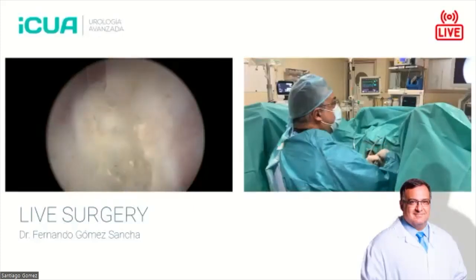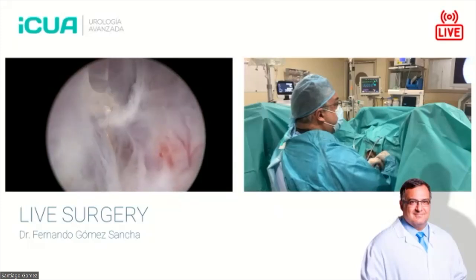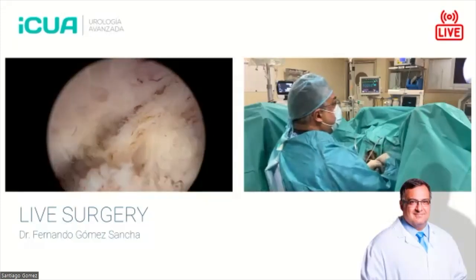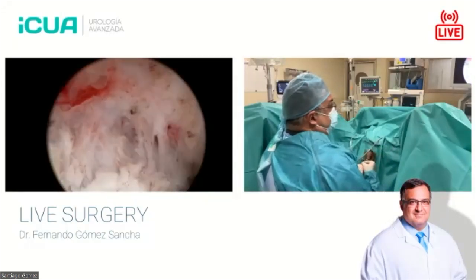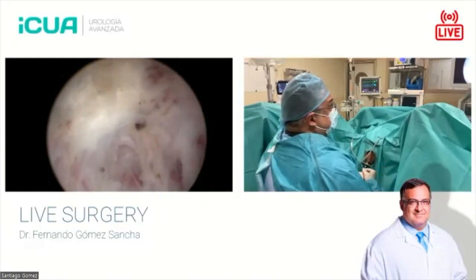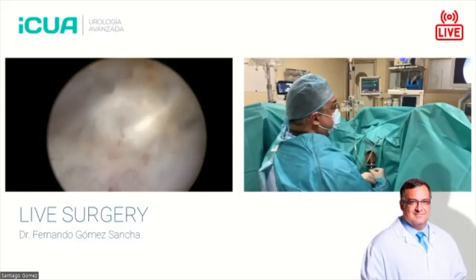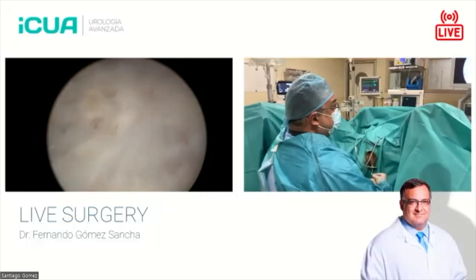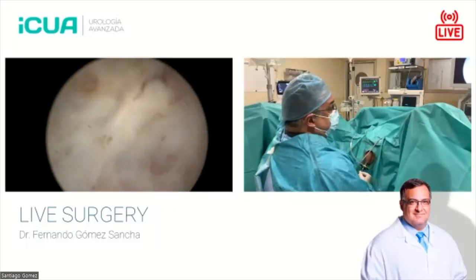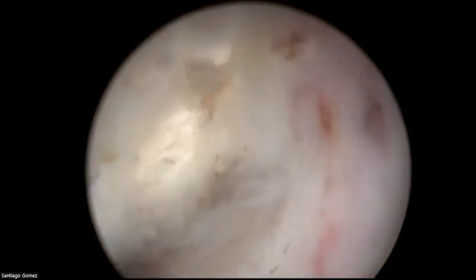No, there's a perfect plane, usually. Yeah, you can see a perfect plane. You know, when I saw this very well, when I was doing GreenLight enucleation, there's a fantastic plane. But of course, as I said before also, the beautiful plane that you can see sometimes is not visible in all cases. And it's not visible in all the parts of the prostate in all the cases. You know what I mean?